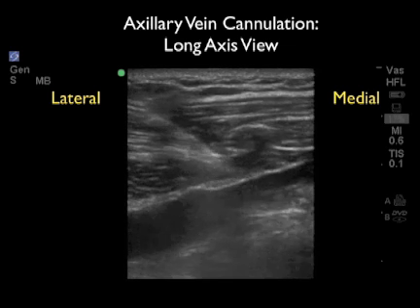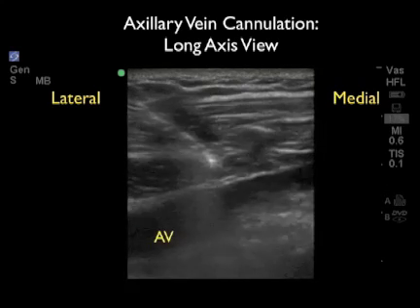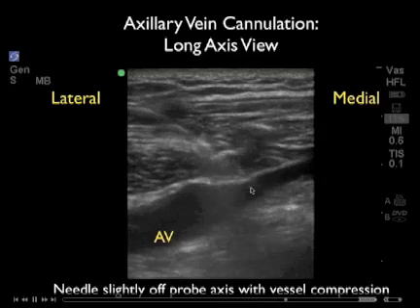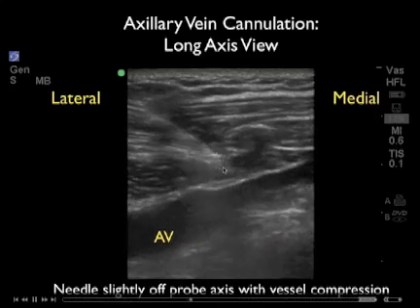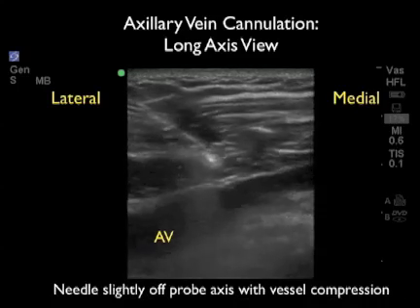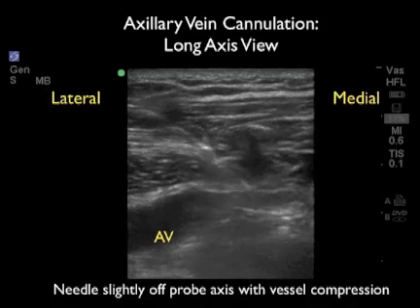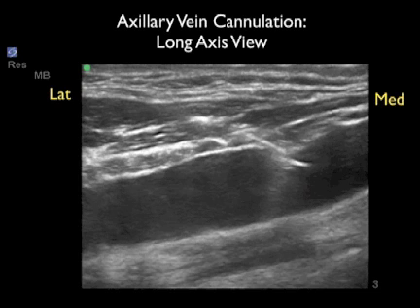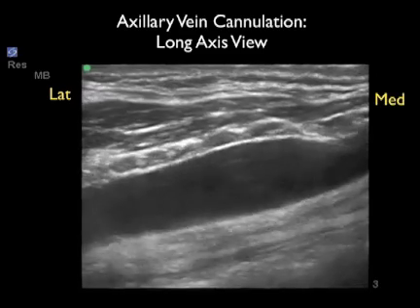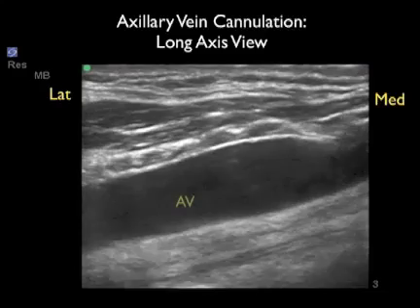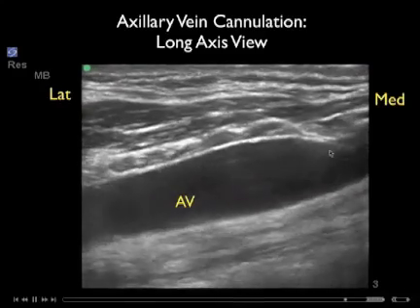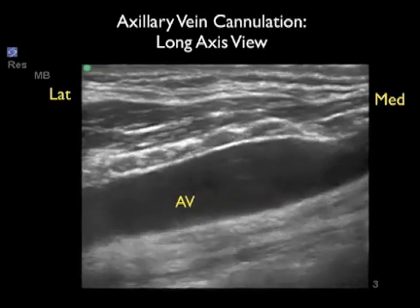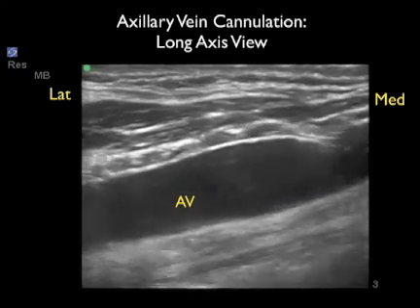In this video clip we'll look at a real-time axillary vein cannulation in a real patient. Here we see the needle coming down from left to right using the long axis view. The images are not quite as crisp because the probe is slightly off axis to the vessel. We can see the tip of the needle — shown by the small arrow — pushing down on the anterior wall of the axillary vein and then entering into the vessel lumen, successfully cannulating the axillary vein. This illustrates the pitfall of the long axis approach: you must be completely in plane with the needle throughout its entire path down to the vessel. Occasionally the anterior wall may tent towards the posterior wall as you push the needle down — a slight pullback will loosen that tissue and free the needle tip within the vessel lumen.